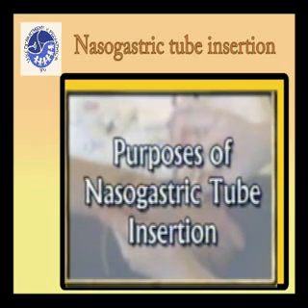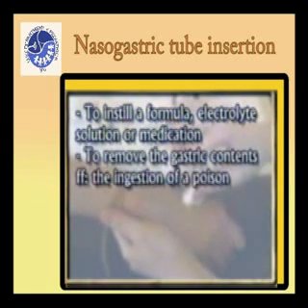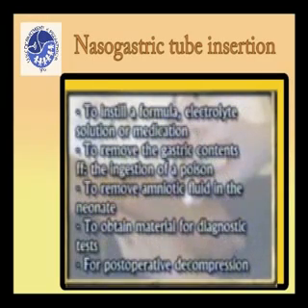The following are purposes of nasogastric tube insertion: to instill a formula, electrolyte solution or medication, to remove the gastric contents following the ingestion of a poison, to remove amniotic fluid in the neonate, to obtain material for diagnostic tests, and for post-operative decompression.